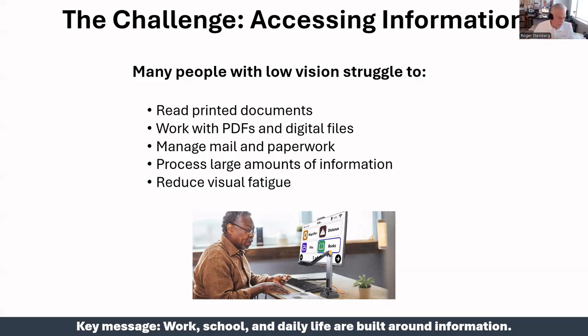As the slide says, the challenge that we're trying to address is accessing information for people with low vision, which could be printed documents, digital files, mail, forms, other work materials that they're trying to get at. But also, many of these tasks require switching between paper and digital content, and that can slow people down and cause visual fatigue, both of which are certainly important.